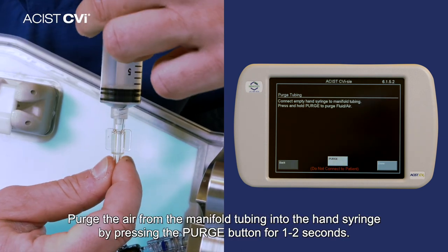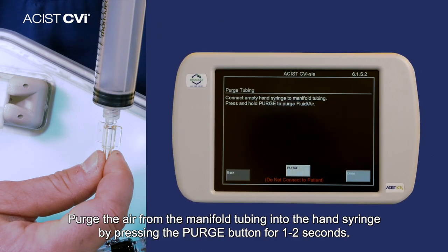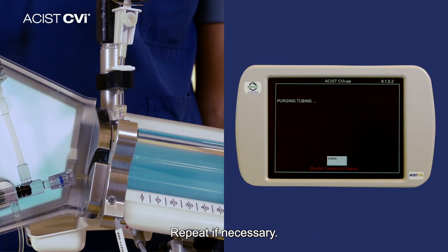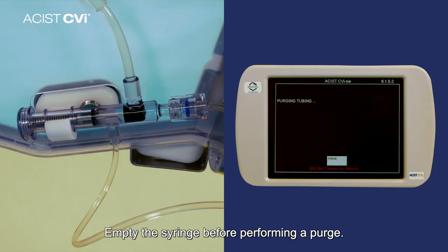To purge and flush the tubing, follow these steps. Step 1. Purge the air from the manifold tubing into the hand syringe by pressing the purge button for 1 to 2 seconds. Repeat if necessary. Empty the syringe before performing a purge. Press Done.